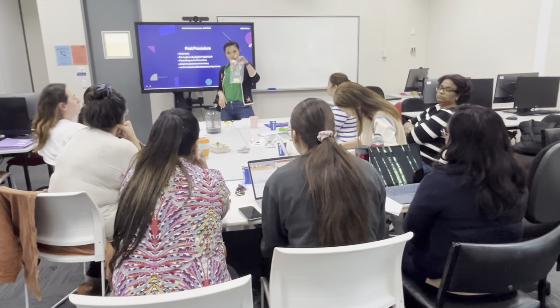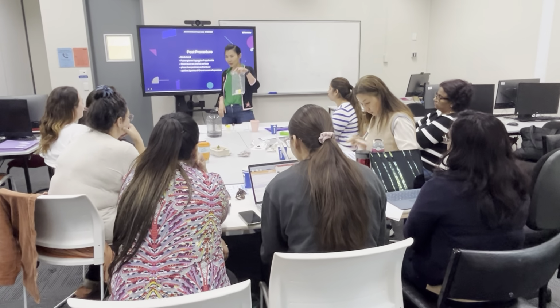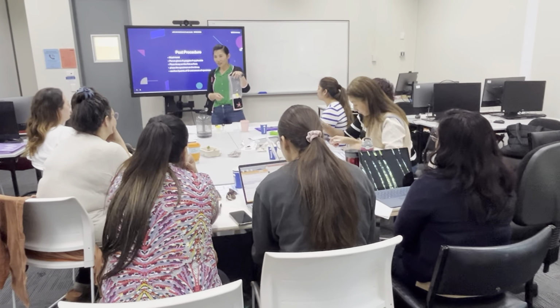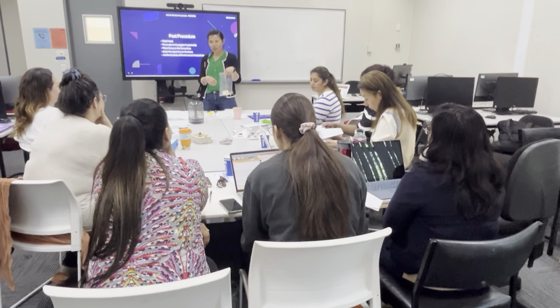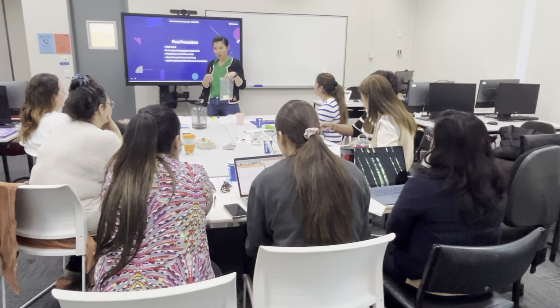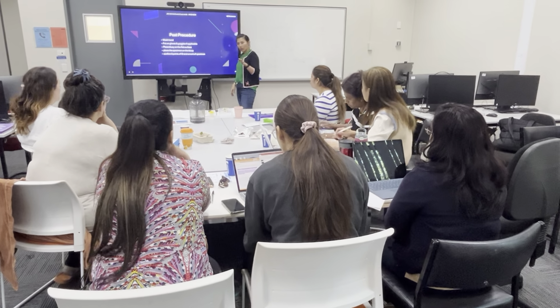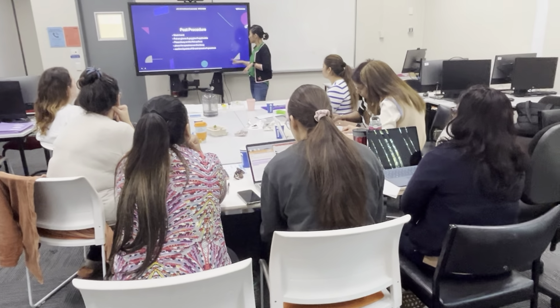So when you handle this, you have to be mindful. Some of them you don't want to touch with your bare hands, because it may be poo, and sometimes they've just done it and not even washed their hands. So you definitely want to wash your hands and put gloves on before you handle this. We're going to teach you how to collect those specimens in more detail. Continuing.